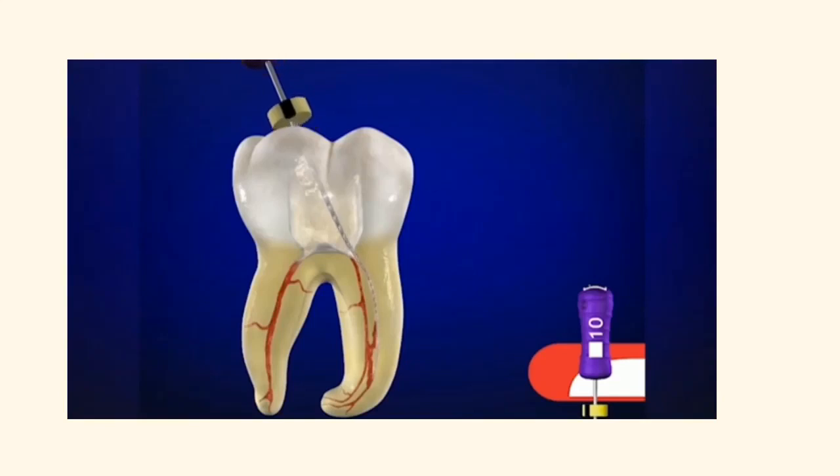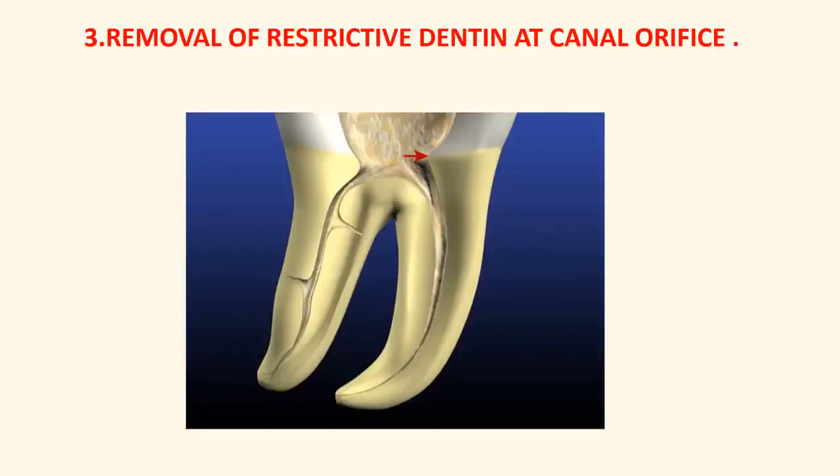Very gentle up-down motion of the file. It is not a definitive instrumentation. Next step is the removal of the restrictive dentin at the canal orifice.